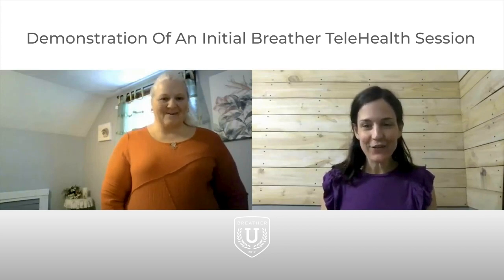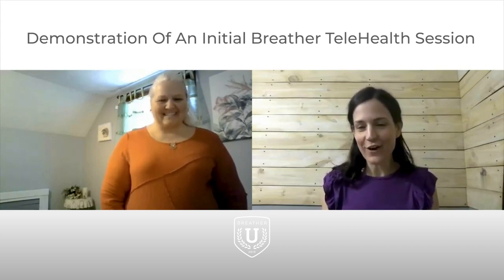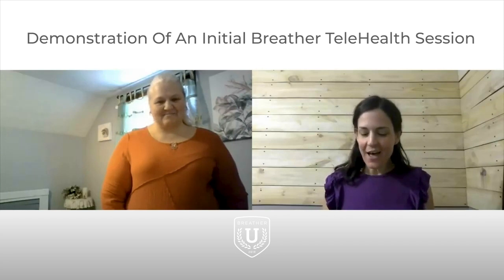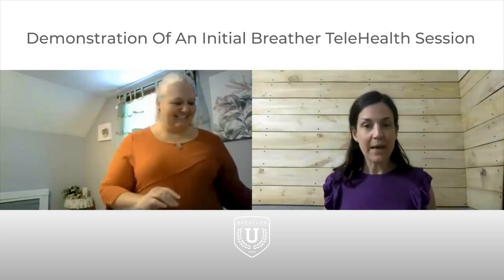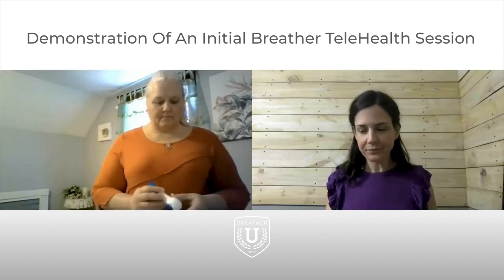Hi, thank you for having me in your home this way for our therapy session. Did you get your breather? I did. Okay, great. Remember on your evaluation, we were looking into your breath support for speech production, and it was a little bit lacking. We did that maximum phonation time and VRI. So we want to target your respiratory muscle strength because your respiratory strength is the power for your speech. So let's go ahead and get your breather out and we'll take a look at it.